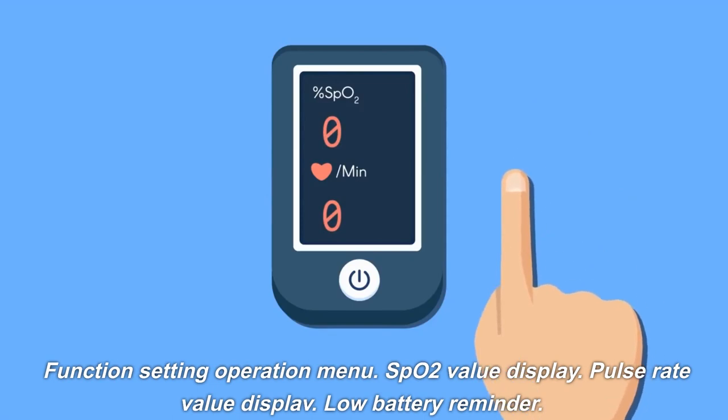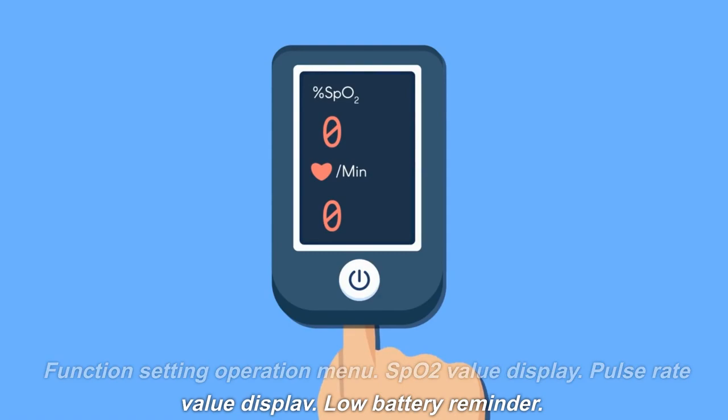Function setting operation menu, SPO2 value display, pulse rate value display, and low battery reminder.